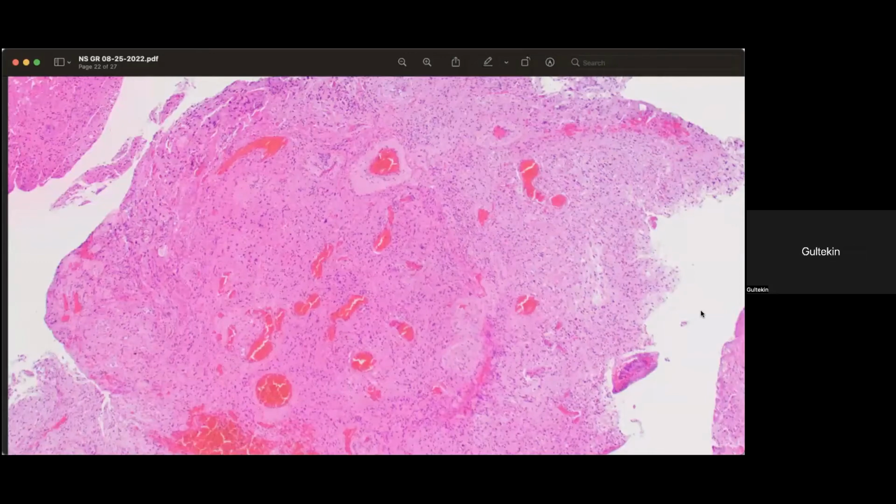Okay, so this is an interesting and unusual case. I remember seeing the frozen on it. As usual, the surgical team was wondering about ependymoma versus astrocytoma. We couldn't find anything that looks like an ependymal lesion, so we said it looks like a low-grade-ish astrocytic neoplasm on frozen.